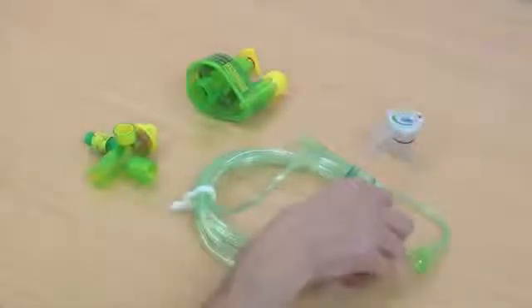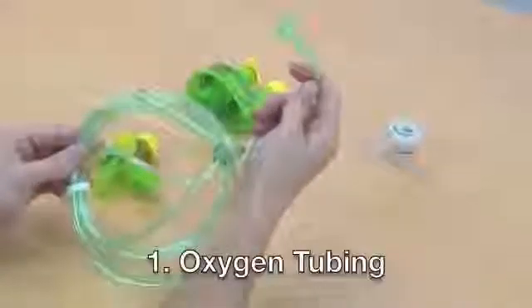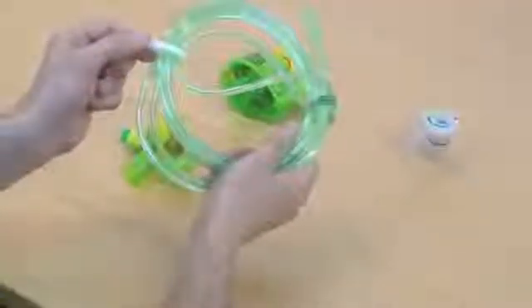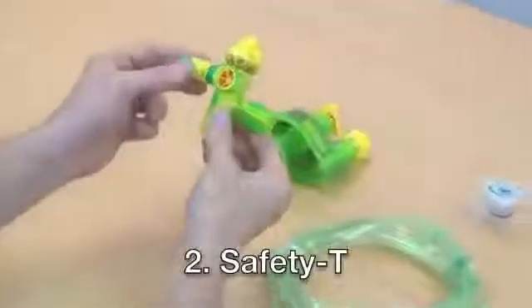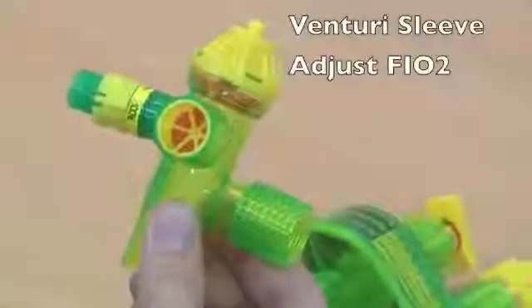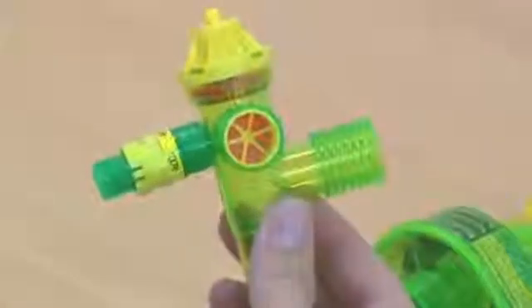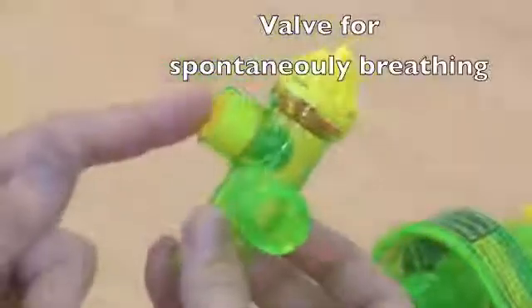The SureVent 2 consists of four parts. The specialised oxygen tubing with the screw adapter — there is a clip on the oxygen tubing which can be attached to a stretcher belt. The Safety T-piece, which contains a Venturi sleeve to adjust fractional inspired oxygen between 100% and 65%. There's a safety pop-off valve at 55 centimetres of water, and a valve to allow spontaneously breathing patients to breathe if there were to be an oxygen supply failure.